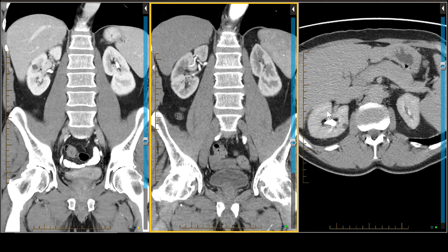When you're lucky enough to have a pre-contrast and post-contrast CT, you take the post, subtract the pre, and if it's more than 15 Hounsfield units, it's enhancing. On MRI, there's something called the signal index, which we can discuss later. To summarize: we use MRI because it's better at detecting true enhancement with fewer artifacts, especially when you subtract. Hounsfield units below 20 — great; above 80-90 — fine; in that intermediate no-man's land, you need a tiebreaker. And it's not size so much as shape — a smooth, round lesion pushes you toward a benign diagnosis.